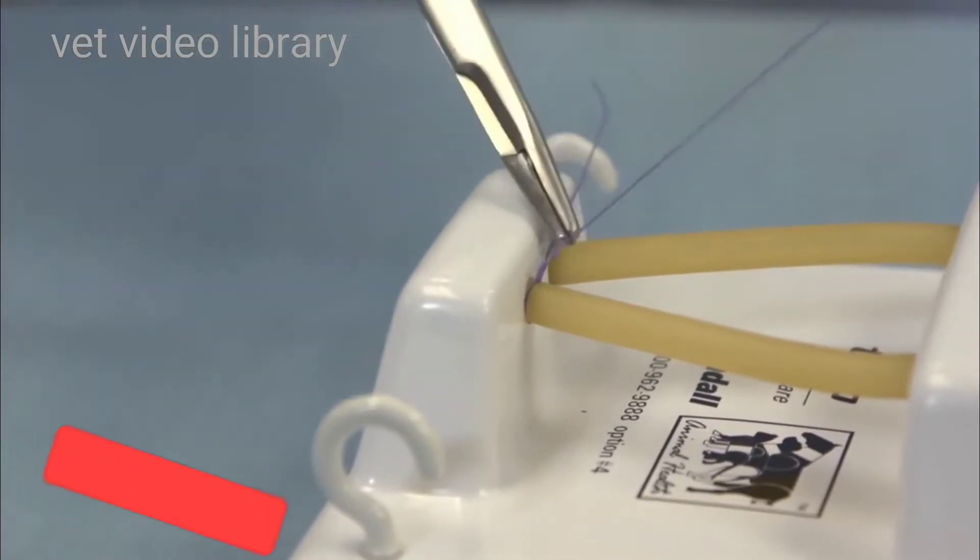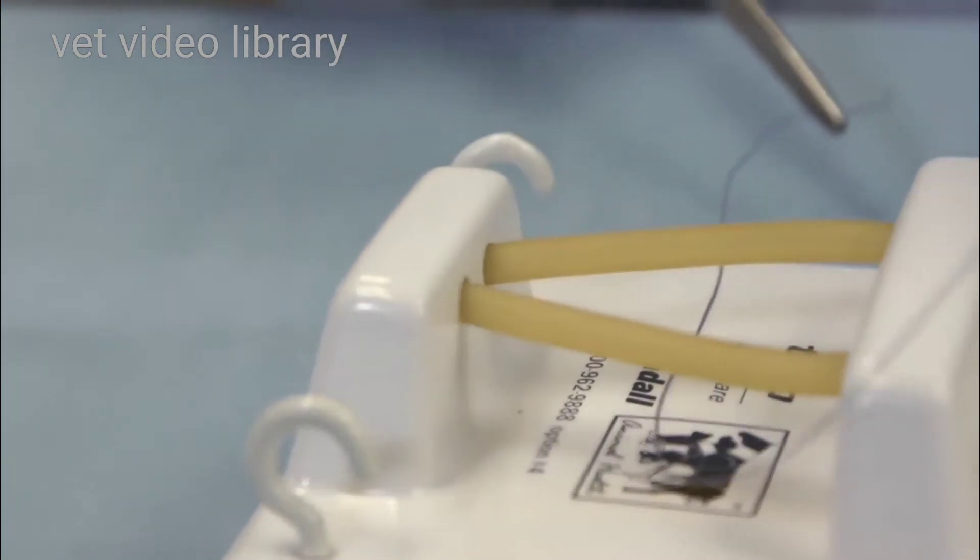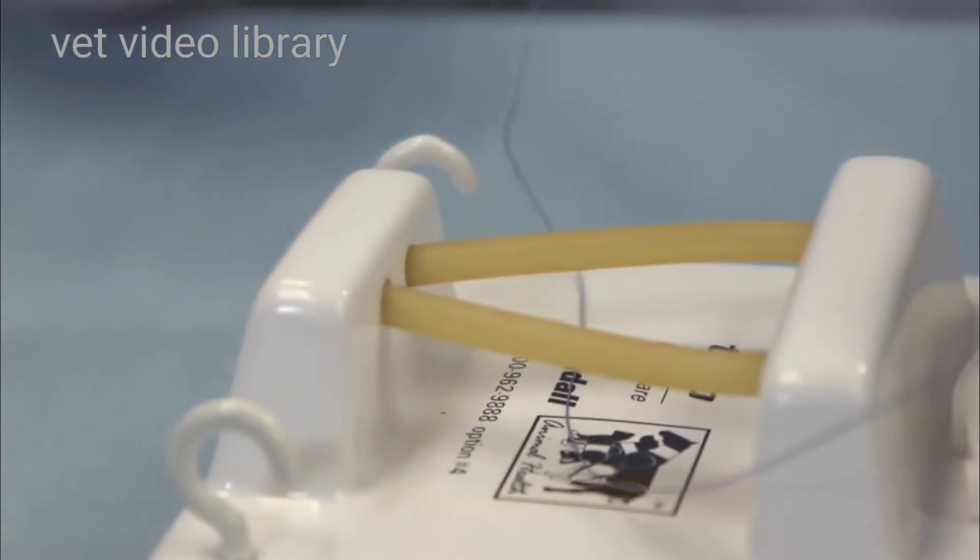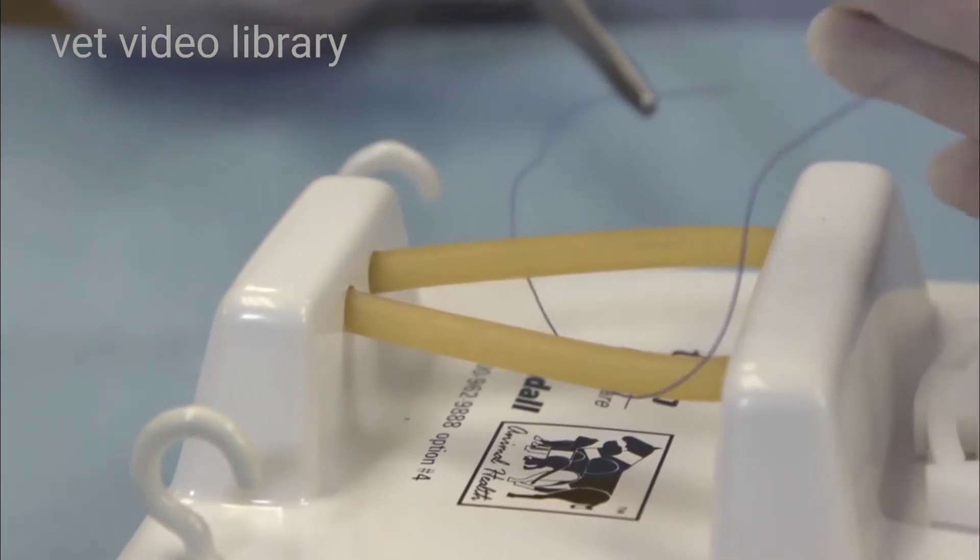So we're going to use a Miller's knot. With a Miller's knot, you pass your suture across the tissue like we have here.